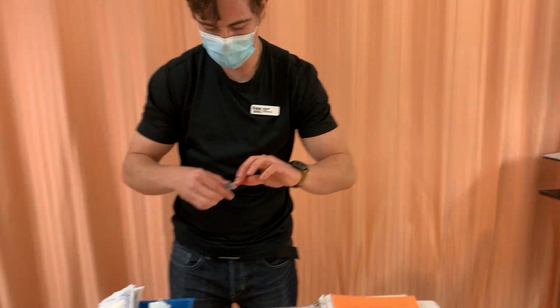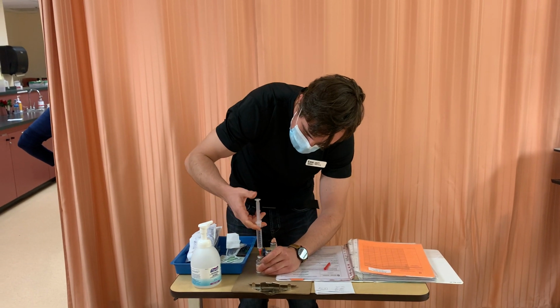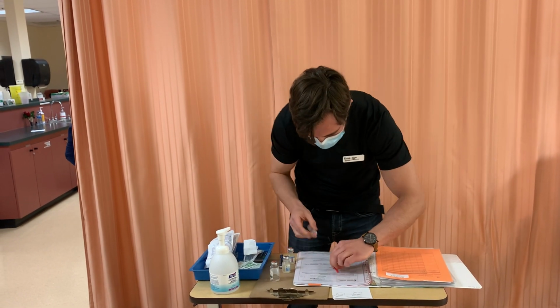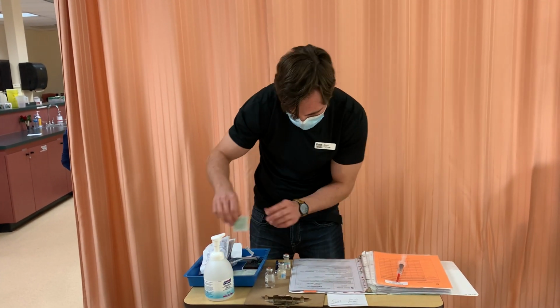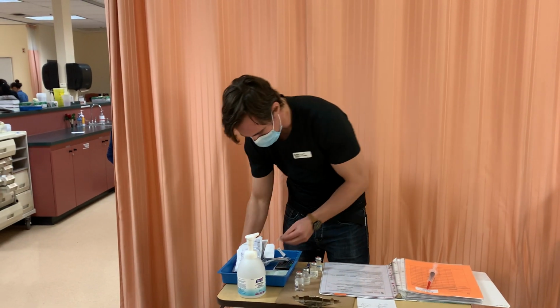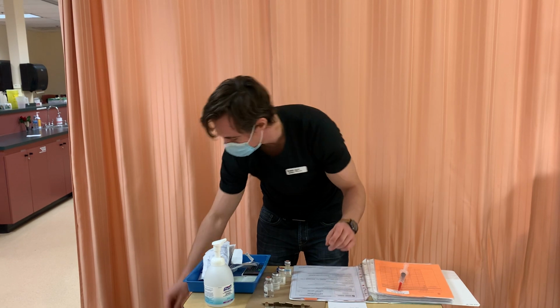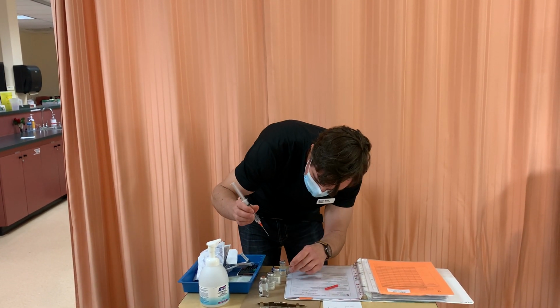Perfect. I'm going to inject that into my vial. Let the air out. Do our scoop method. And then I'm going to need another 10 ml of sterile water. So I'm going to swab the top of that off for 30 seconds, let it dry for 15. Inject our air.